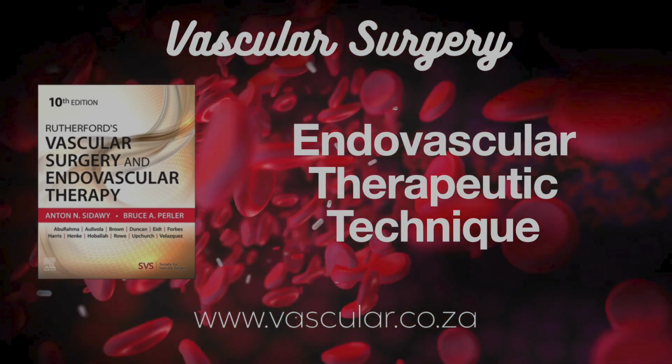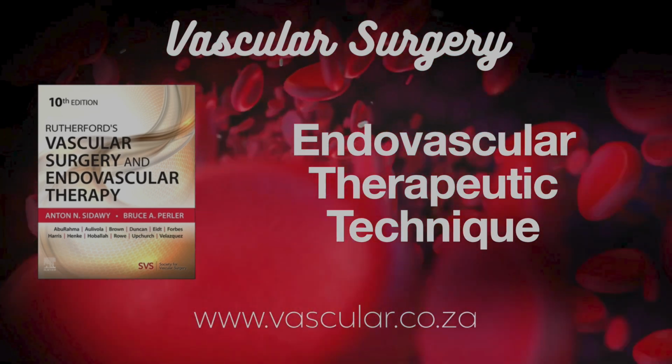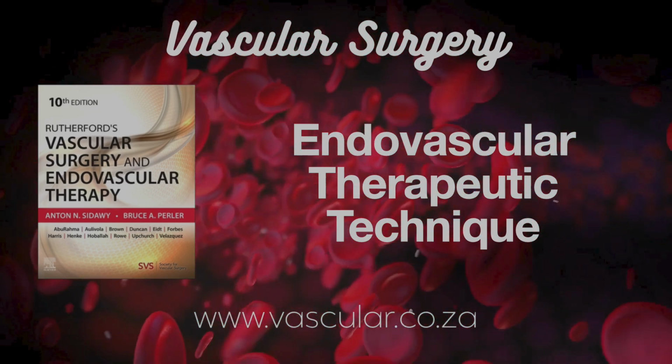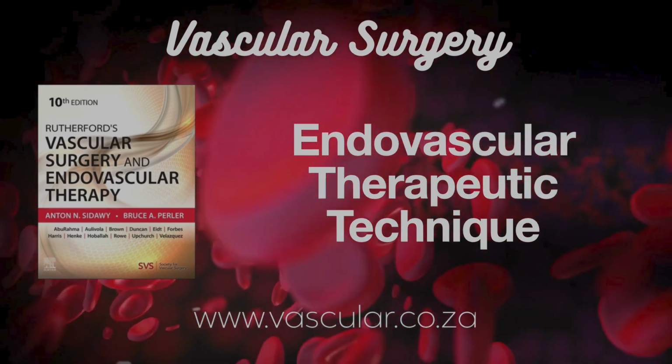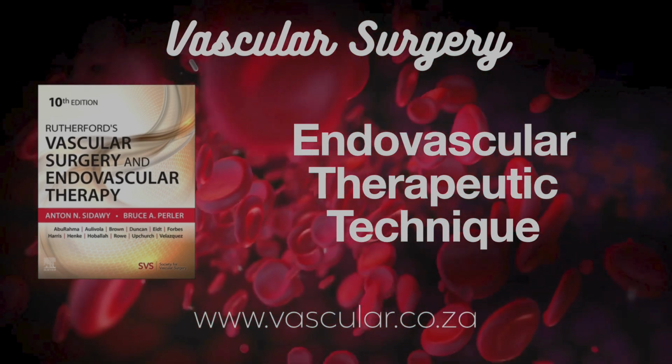Accessing the vessel and getting to the lesion sounds basic, but critical. Absolutely fundamental. Safe, effective access impacts everything. Where you puncture depends on where the blockage is. Common femoral artery, CFA, in the groin is most common for legs.